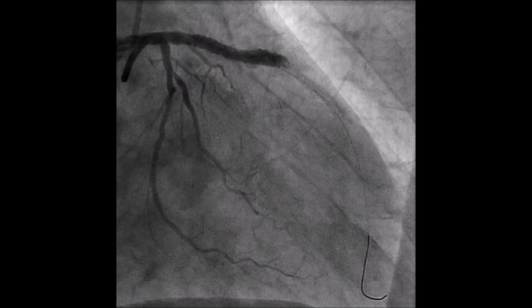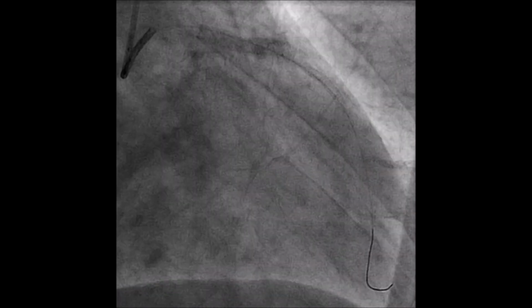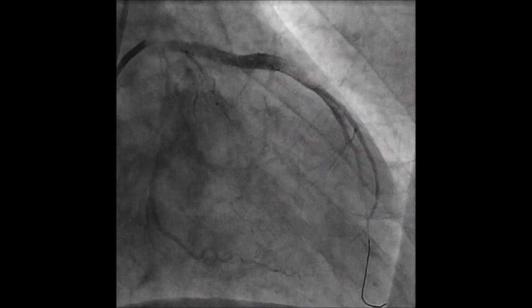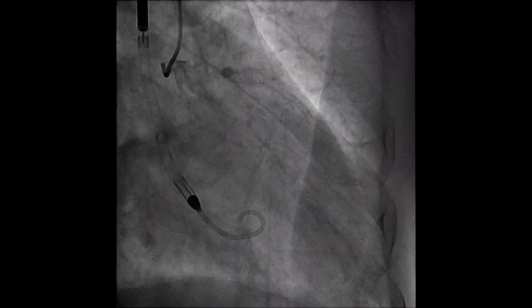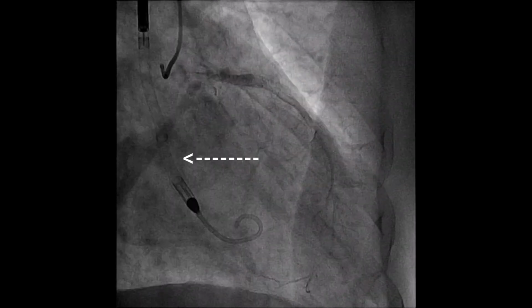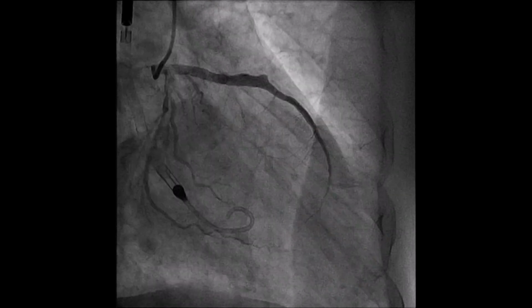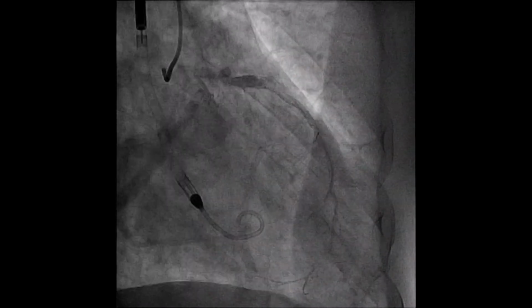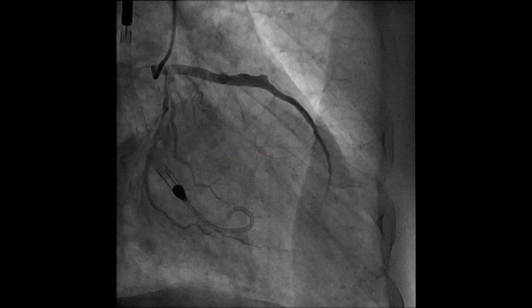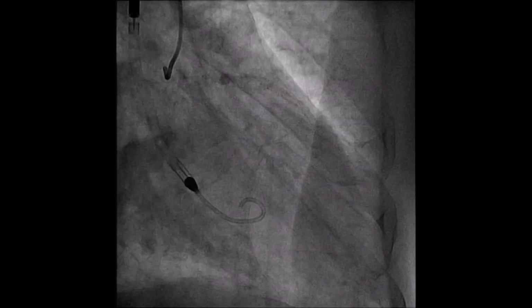Meanwhile, if coronary perfusion does not improve and ischemia prolongs, it is usual that the patient enters heart failure or cardiogenic shock. For this reason, applying circulatory support measures might be necessary, for example the intra-aortic balloon pump, or, as in this case, a percutaneous ventricular assistance. And so, after securing clinical stability of the patient, the best we can do regarding coronary interventionism is to adopt an expectant behavior, because continuing with the procedure could definitely compromise the little blood flow that we helped return.